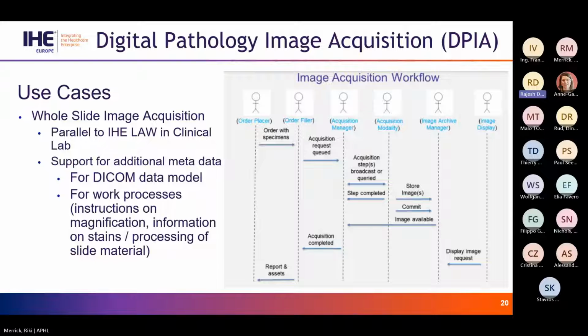We'll do a little bit of a deep dive. So whole slide image acquisition, this is really paralleling the laboratory analytic workflow in the clinical lab. And it has support for additional metadata that needs to populate the DICOM data file and to handle the typical types of information and processes needed in the acquisition of a whole slide image, such as instructions on magnification, the type of stains, the slide material, that kind of thing.